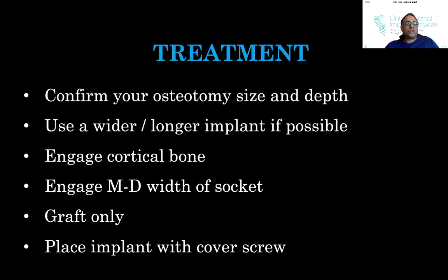So to treat a case where you don't have stability, please confirm your size and depth, okay? Because oftentimes it's the depth, it's not deep enough. Or you prepped it too big. If possible, use a wider, longer implant. And this is where having a good safety zone when you're planning your implants comes into play. Engage cortical bone. So engage the floor of the nose, floor of the sinus. Or I'll even talk about the lingual plate, but that's again more advanced.